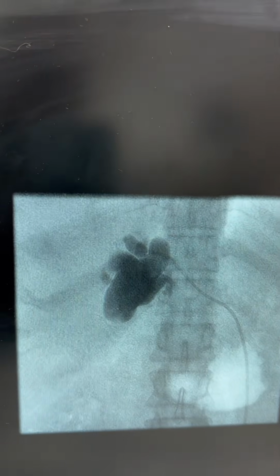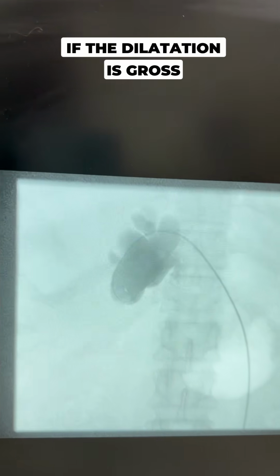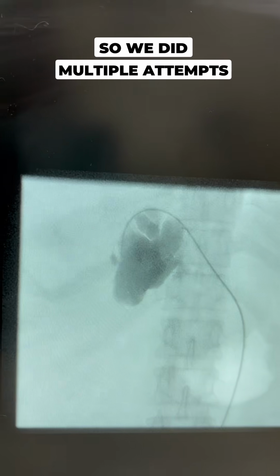Now the next step is to insert a guide wire through this KMP catheter. You can see that we are passing this guide wire through the KMP catheter. And this is one of the difficult steps in PTBD if the dilatation is gross. So we did multiple attempts.